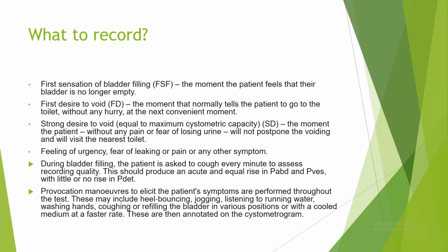Now there are some provocation measures. In case of urgency, if the patient has sensory urgency or something like that, we have to do these provocative tests. What are these provocative tests? Jogging, heel bouncing, listening to running water, washing hands, dipping the hand in cold water. These are the different positions and actions that we ask the patient to do, and they should also be recorded on the graph, that at this time the patient has jumped, or at this time the patient has dipped her hand in the cold water.